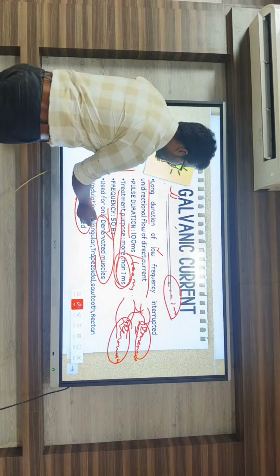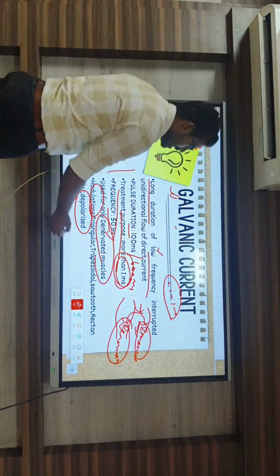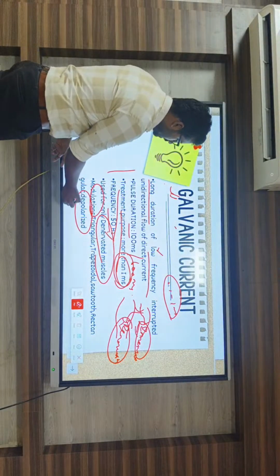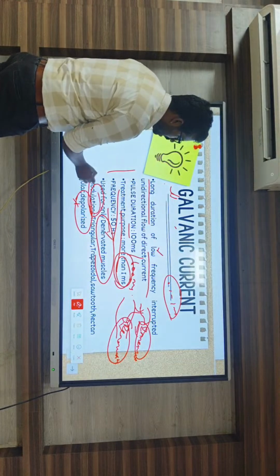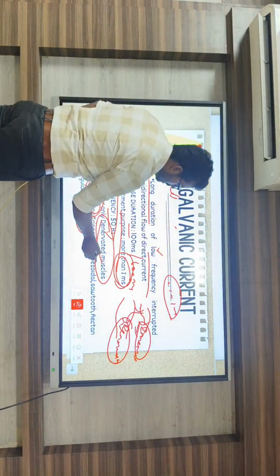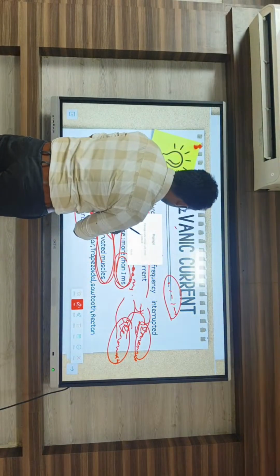What are the modulations basically? First, triangular, trapezoidal, sawtooth, rectangular and depolarized. Only the depolarized modulation is used with this type of current over the denervated muscle fibers. Let's discuss that.